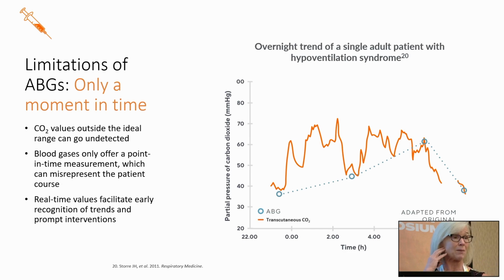You don't know what's coming up. So turning on your headlights gives you continuous visibility and a lot clearer picture. I think that's what transcutaneous CO2 monitoring is like. Having that full picture lets you know where these curves are, not just a snapshot. Oh, there's a curve. Oh, why am I in a ditch?